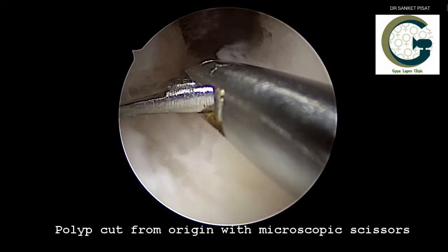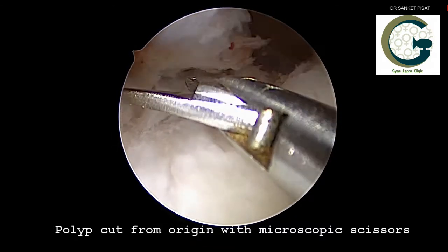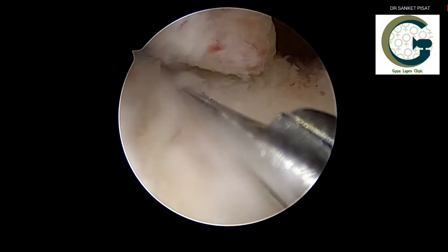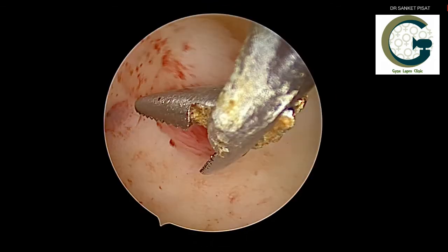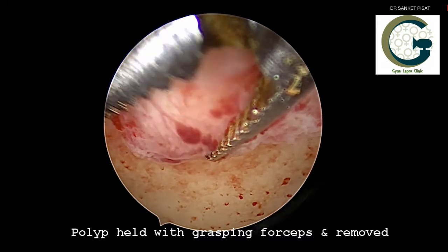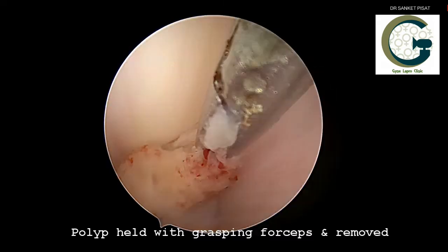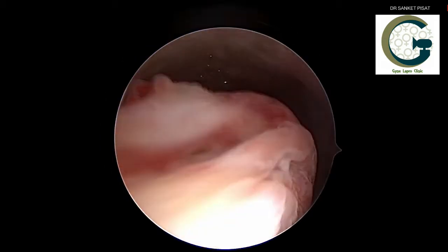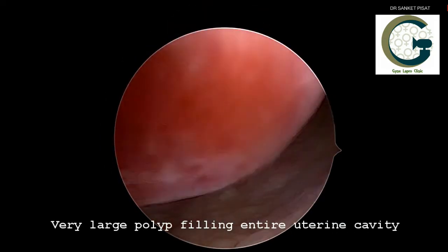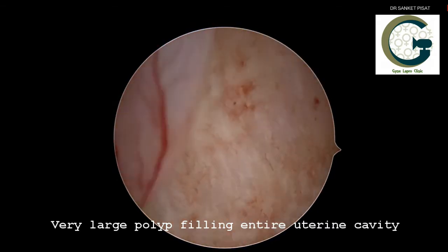Because we are using a magnification of up to approximately 20 times the normal size, the tissues appear magnified and precise, clear surgery can be performed. Once the polyp has been detached, the polyp is held with a grasping forceps and gently removed from the patient's body without causing damage to any other structure. Sometimes the polyp may grow to very large sizes.